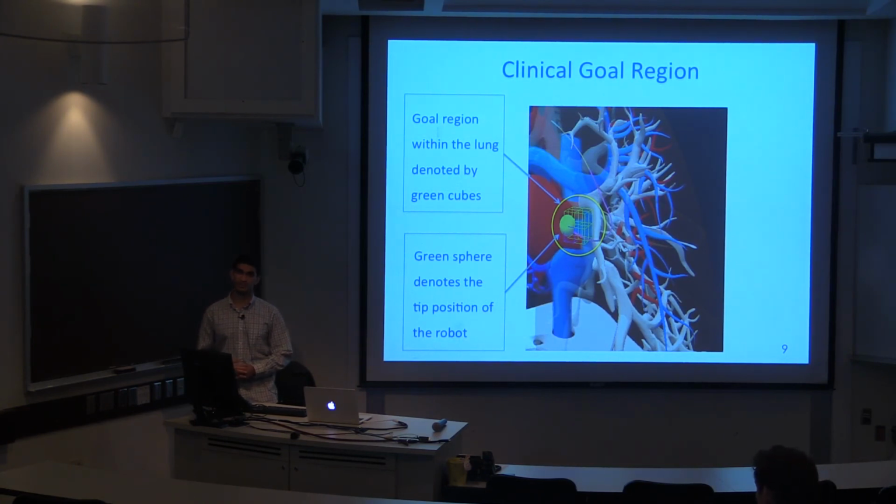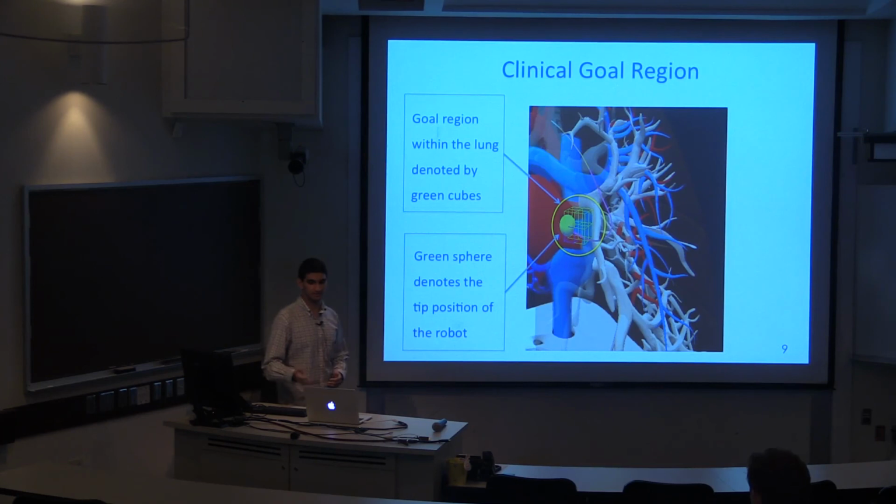It can be anything the physician wants. It could be a cutting tool for a biopsy or some incision. During the operation, it can be really anything that the physician wants, but that's not the focus of my research. It can be a cutting tool, it can be a camera, it could be something to biopsy these nodules with. Any more questions?